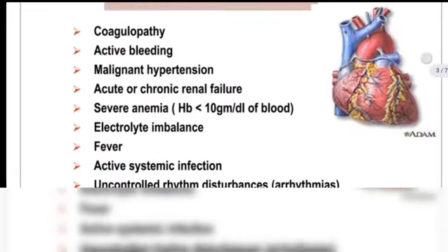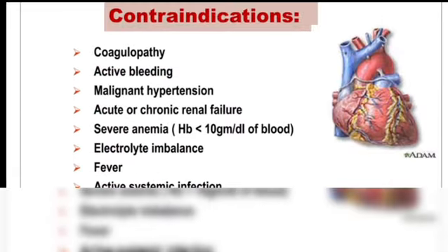There are also some contraindications, that is, cases in which we can't do this angiography study.